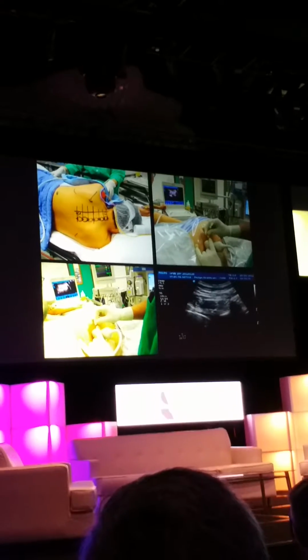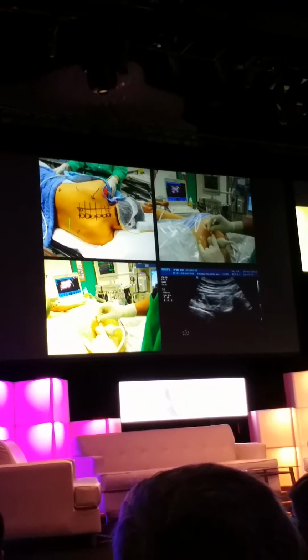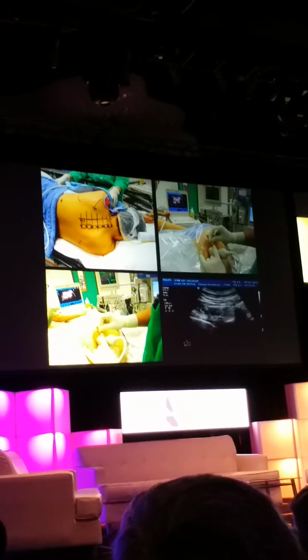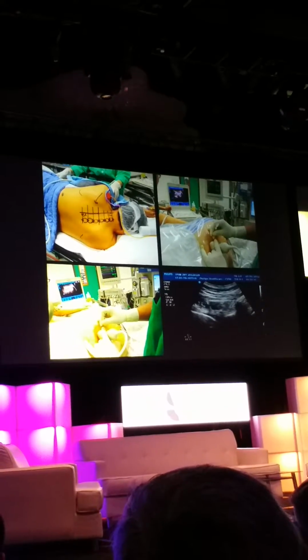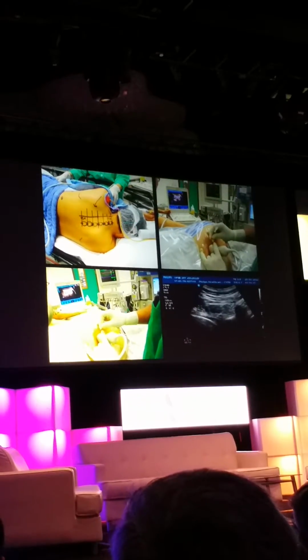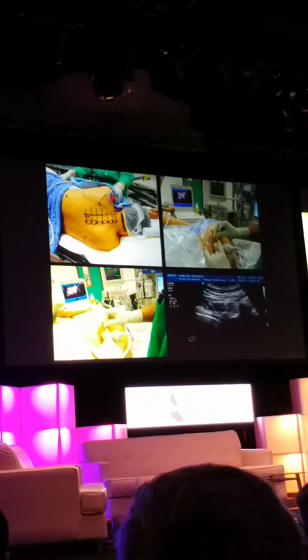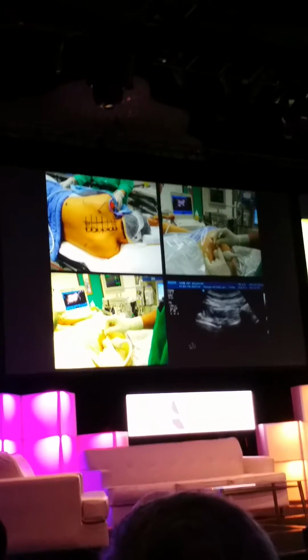So the ergonomics are like so. You can see the patient in the lateral position because we perform multi-level injection. We sedate them. We also give them some ketamine for analgesia. The needle is introduced from lateral to medial, starting from T6, and we move up to T1, so that you don't forget which one you've injected. And you can see here the needle is introduced at quite a steep angle. And as you can see, the tip has now entered the paravertebral space.